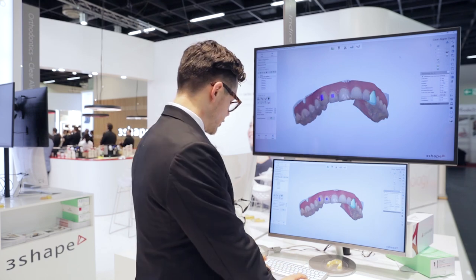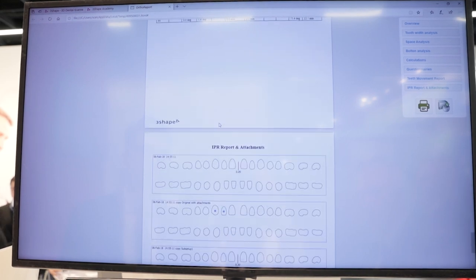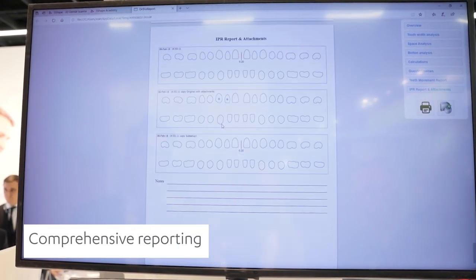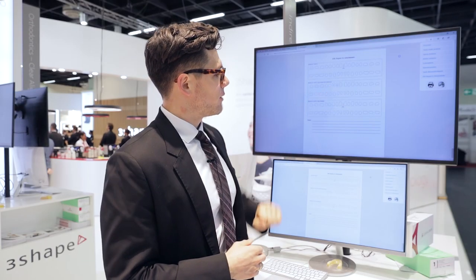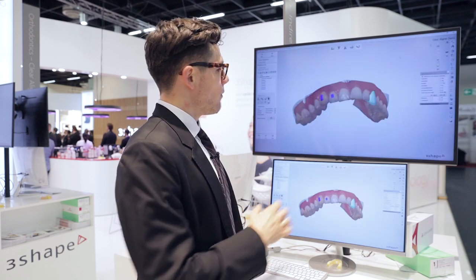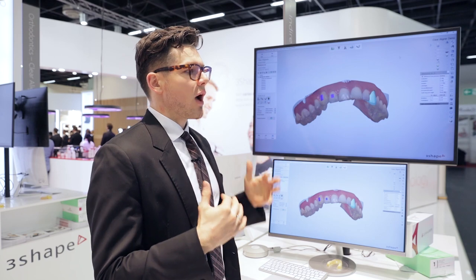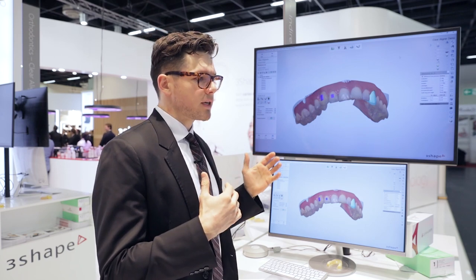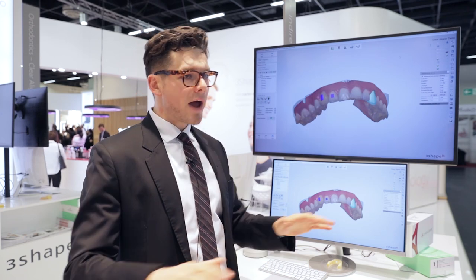The last thing I want to show you is our reporting. We've made a new report template and added an IPR report and attachment report section, where you can very easily see where you need to do your stripping and where to put your attachments. You can pass this on to your doctor or whoever is helping you treat the patient. It's a really powerful tool — all together creating a great package that will help you for the vast majority of your cases, while still being part of the great Trios ecosystem with the widest range of providers.